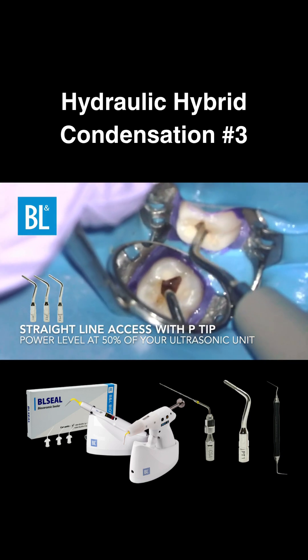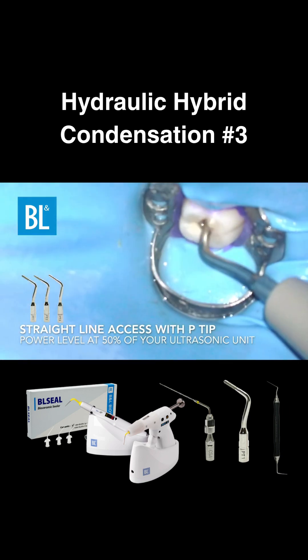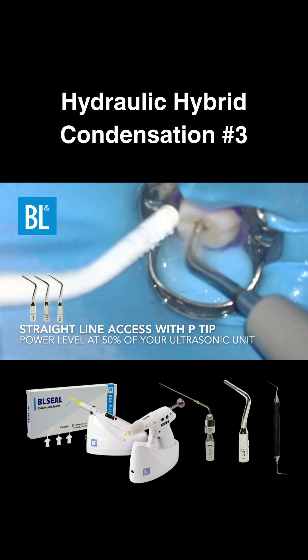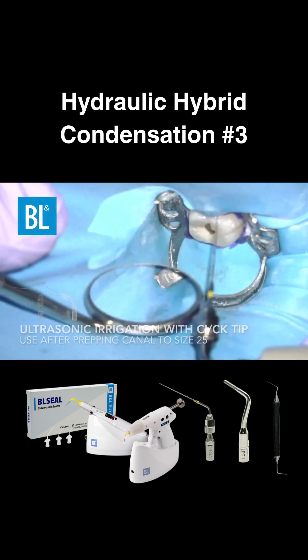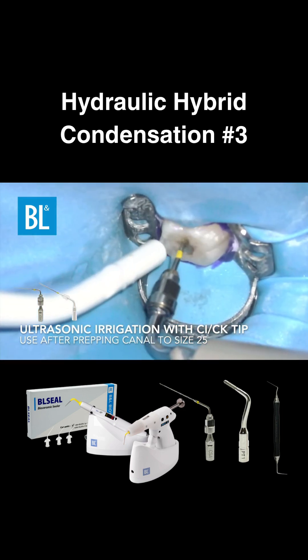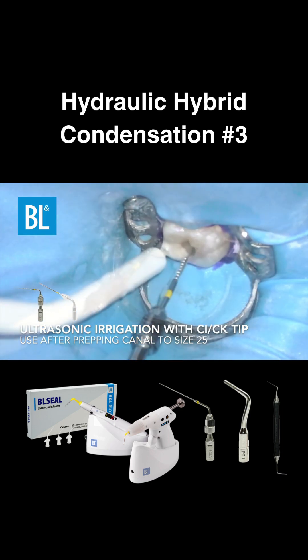Use the ultrasonic P-tip to not only see where you're drilling but also create a straight-line access. Ultrasonic irrigation eliminates the need to recapitulate after rotary use. Acoustic streaming helps clean lateral canals while reducing hypoextrusion for safer, more effective chemo-mechanical instrumentation.